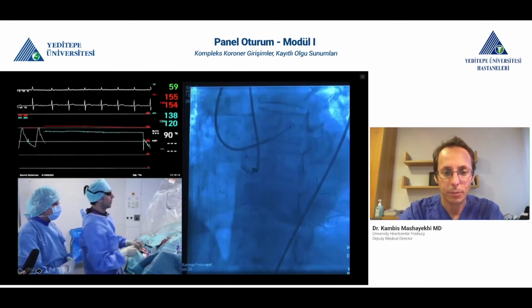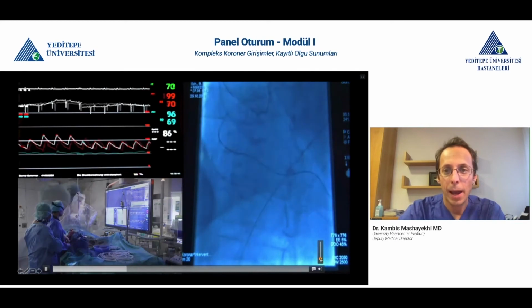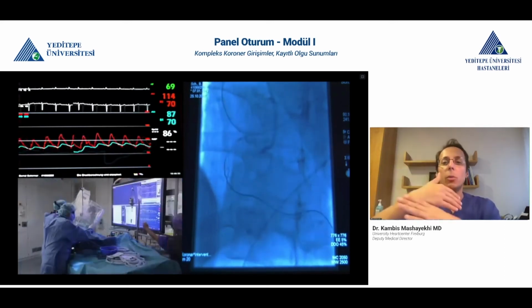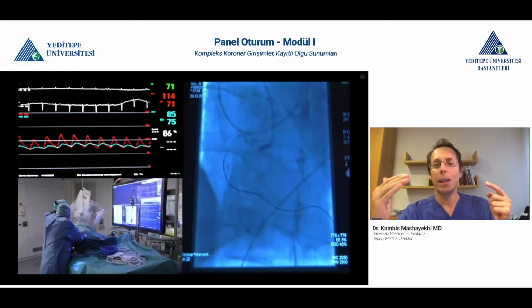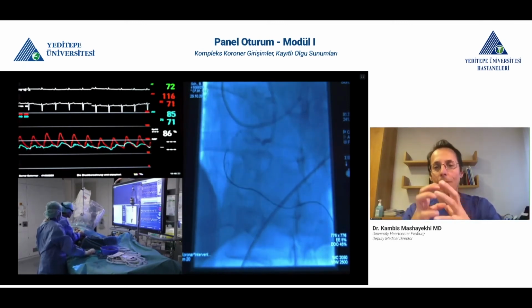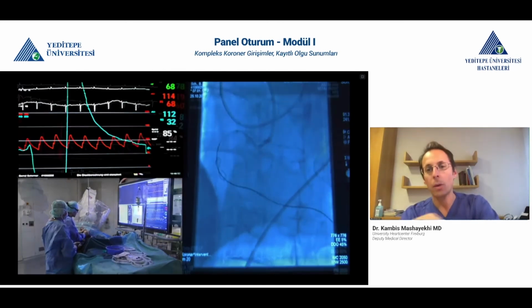All right, so this is a huge RCA connection, as you can see here. And there are two knuckle wires, antegrade and retrograde. It's a big, big artery. And finally, the knuckles were overlapping, and you have an antegrade mother and child catheter. And there, after dilatation, you create a space where your retrograde wire can go. So you have an antegrade dilatation here, as you can see. And after this dilatation, your retrograde wire is able to enter into your mother and child catheter.